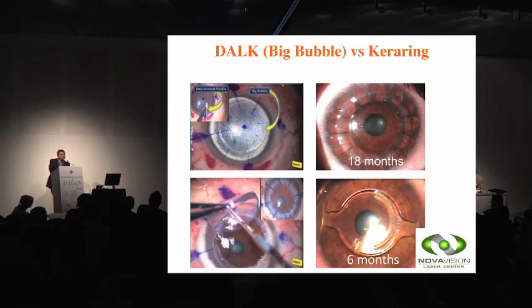These patients will probably require a laser procedure, either a PRK or LASIK, and then we have this option to combine a ring and a phakic IOL of your choice. It can be an ICL, toric ICL, or in this presentation I will show you the results of 10 patients that received in combination, first the intracorneal ring, and 6 months later the Cachet anterior chamber intraocular lens. And these patients recover very fast, as you see, usually in a period of 6 months.